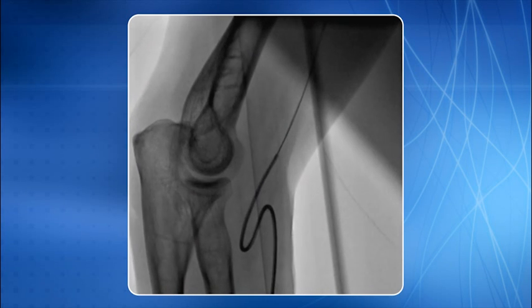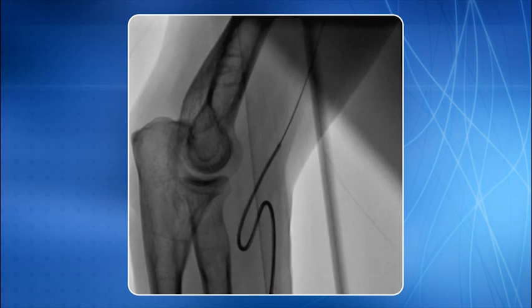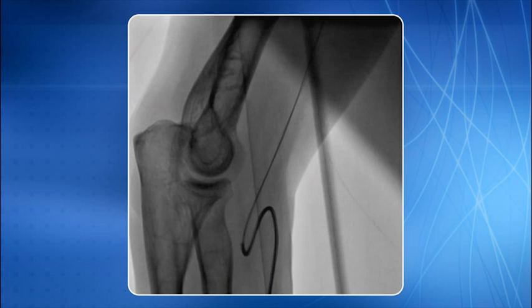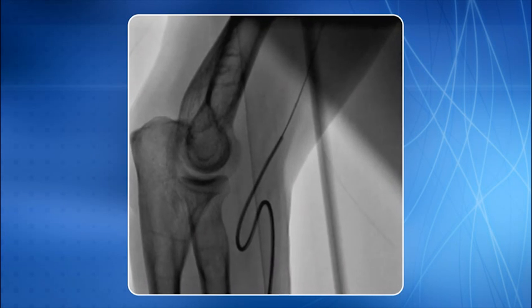We crossed the loop with a 0.014-inch soft tip PTCA guide wire and tried to negotiate the catheter across the loop. However, we could not go beyond the first hairpin loop. So, we used the buddy wire technique. Another PTCA wire was also negotiated across the loop, and now the catheter was able to take the turn at the second hairpin loop. Once the loop was crossed, the procedure was completed in the usual fashion.